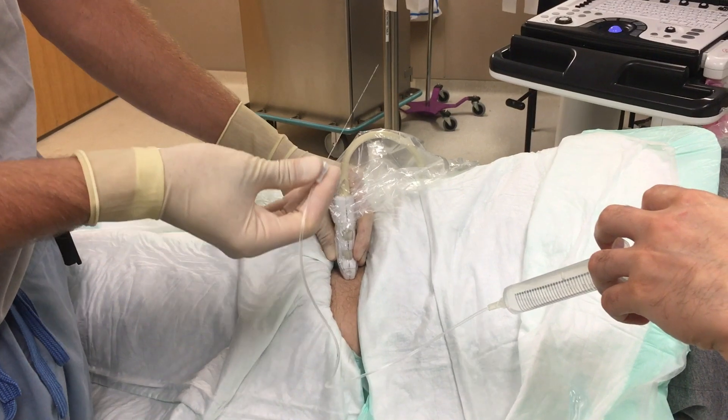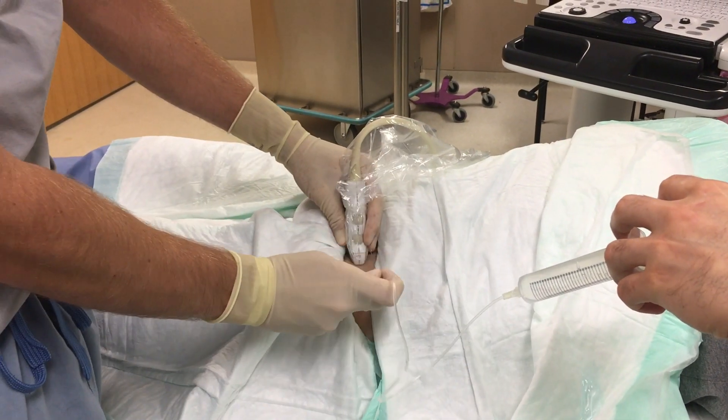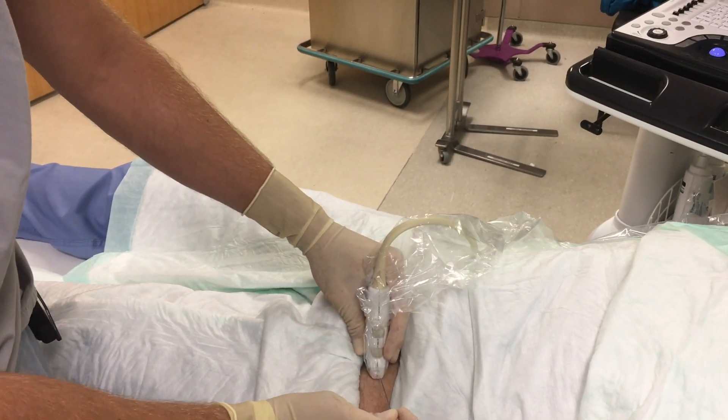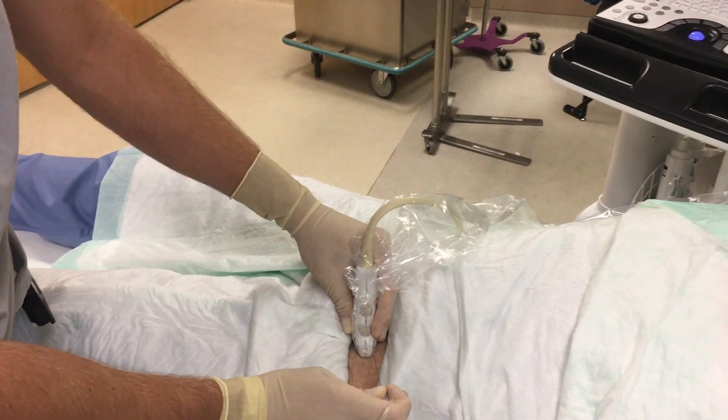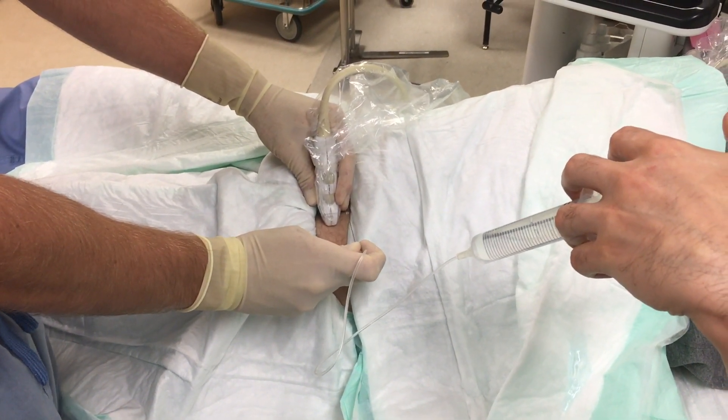Using the in-plane technique, hold the ultrasound probe with your non-dominant hand and the needle with your dominant hand bevel up. Ideally this is a two-person job and you will have an assistant who can hold the syringe so that you can stabilize your location through the fascia iliaca once you pop through the layer.